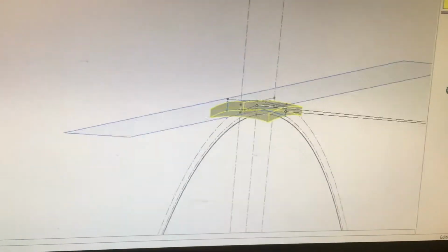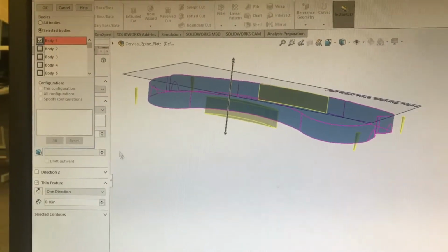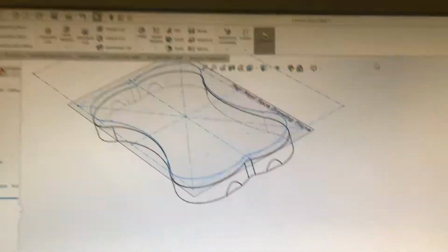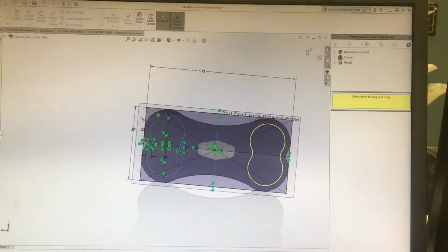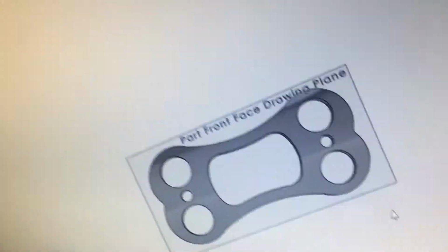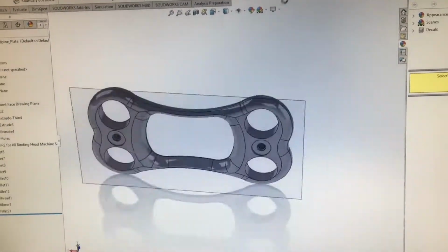In order to make the curvature of the implant fit with the cervical region of the spine, research was used to find cervical spinal radius of curvature, as well as dimensions such as plate diameter and height. The dimensions of the implant, 44 by 22 by 4 mm thickness, were determined using market research.